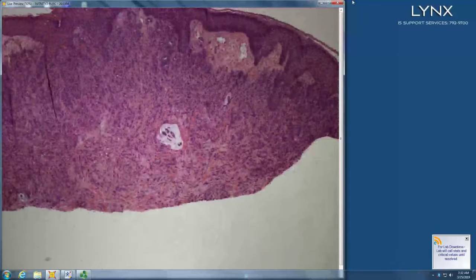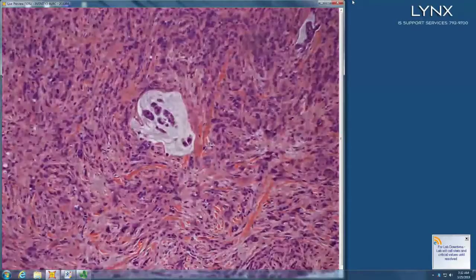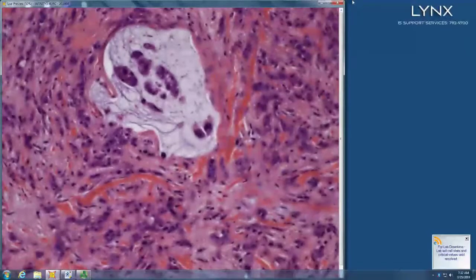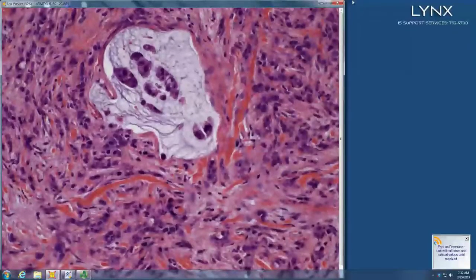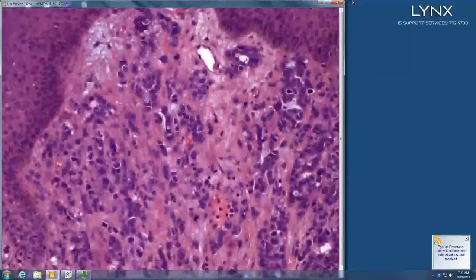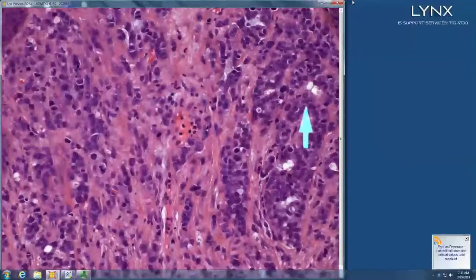Yeah, I can try to get off this. Looks like you have an infiltrate in the dermis. Some mucin in there. So like that blood cell extravasation and neutrophils there. And then how about all of these?